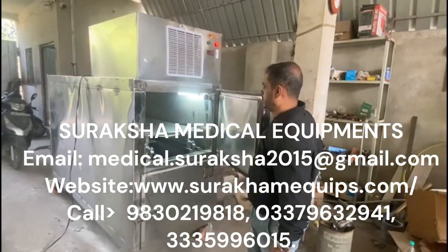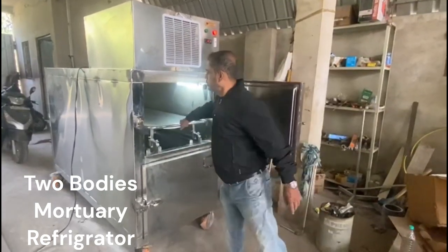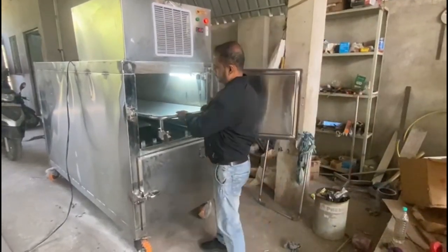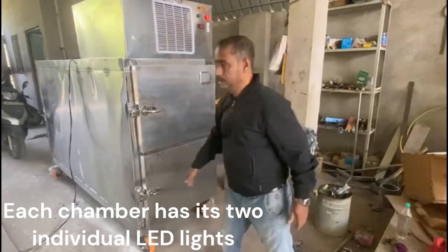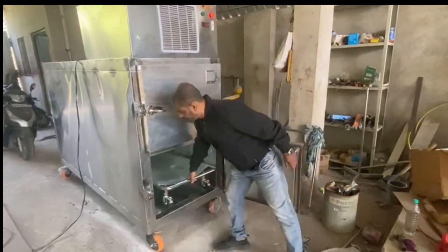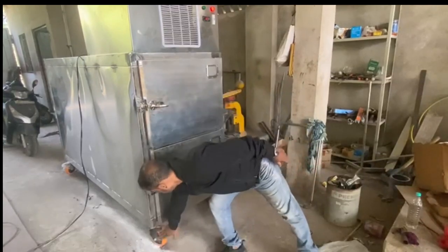Mortuary freezer. Here, two dead bodies can be preserved. The whole structure is made of high quality stainless steel. The whole unit is mounted on four casters here.